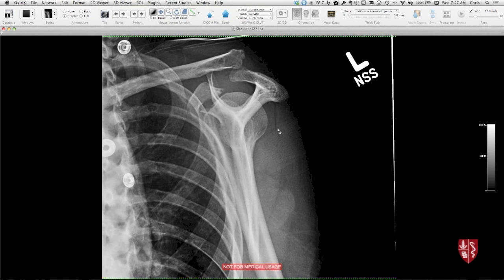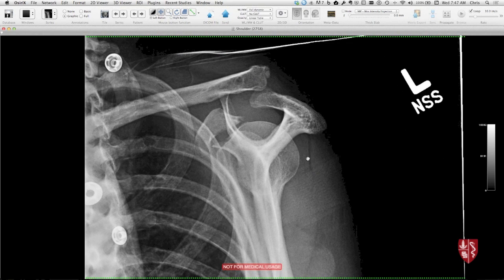Take a look at this oblique here. Does anybody see a fracture? Yeah — so it's fairly obvious in this example, but you just have to be able to kind of unwind the anatomy on these different radiographic views. So here's the Y view — scapular spine, coracoid, scapular body here. And if you try to follow the coracoid out here, it goes out and then there's this lucency across it. So the coracoid's fractured across the base, and it's displaced a little bit. Sometimes these can be non-displaced and very hard to detect — a situation where CT may be done and detects it, or the patient has a lot of pain not explained by the radiographs and CT shows an unexpected coracoid fracture.